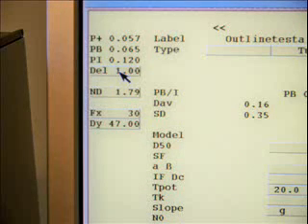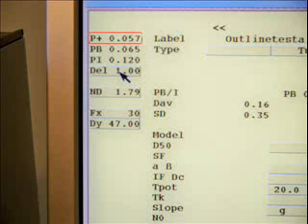Based on the calculated TCP and NTCP values, the composite P-plus value is automatically calculated. The delta value handles the level of independent response between tumor and risk organs. For delta 0, the response is completely dependent, and for delta 1, the response is completely independent.